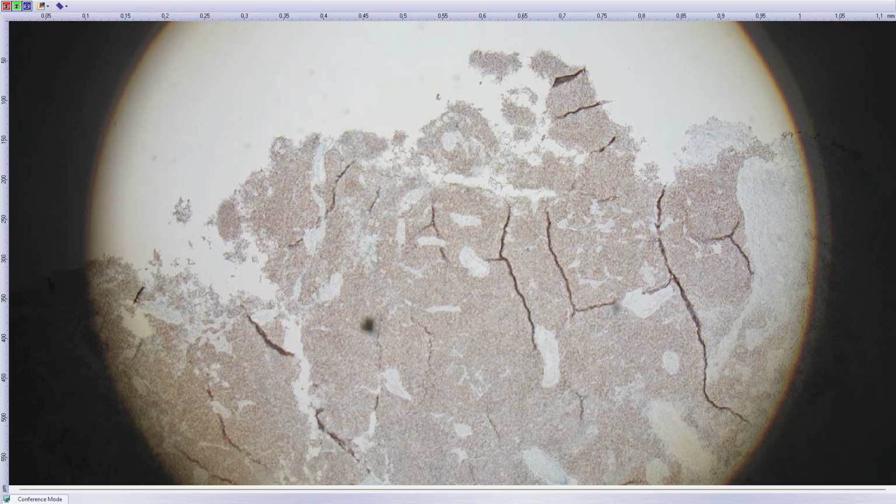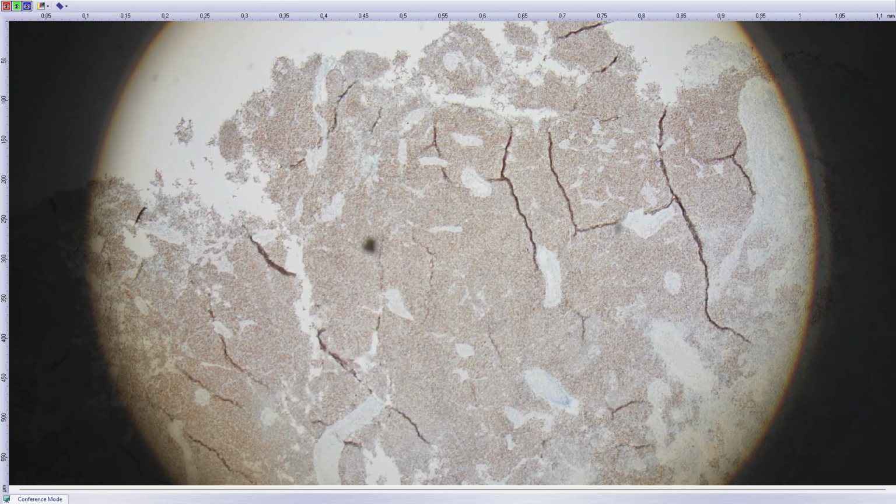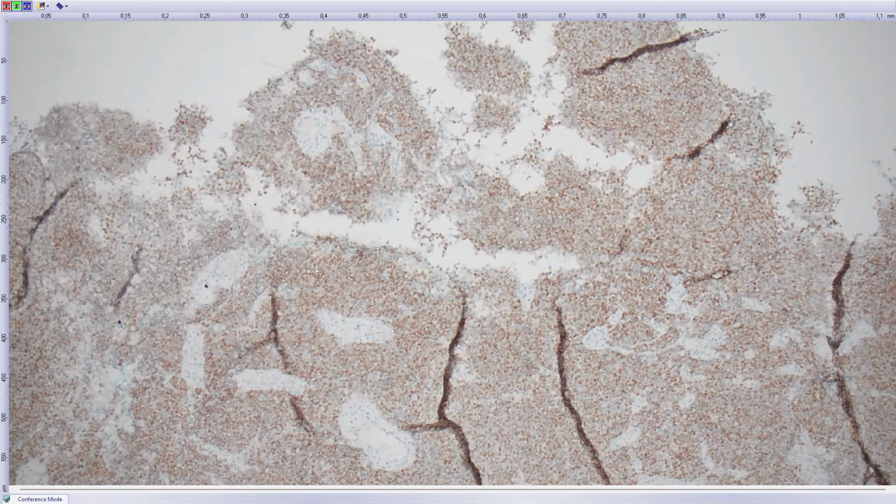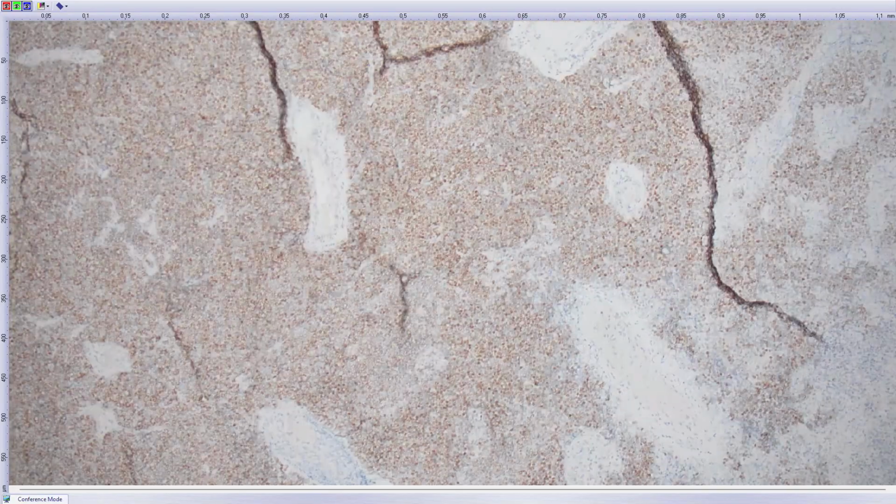So the second stain you should do for neuroendocrine carcinoma of any type, besides cytokeratins, is obviously some neuroendocrine marker. So this is INSM1, which I like the best. And you can see again diffuse nuclear expression. That's why I like INSM1, because it's a nuclear marker, very easy to read. And it's relatively specific, not absolutely specific, but it's more specific than synaptophysin and more sensitive than chromogranin.